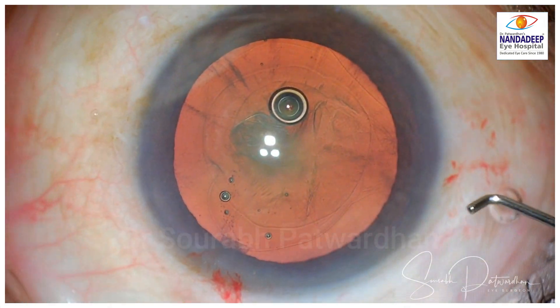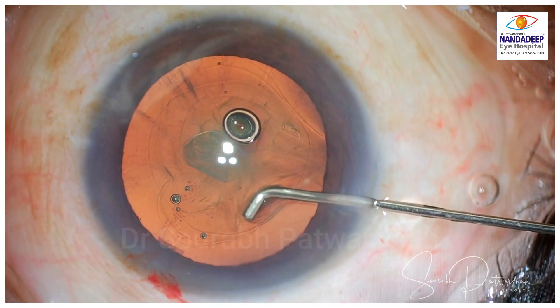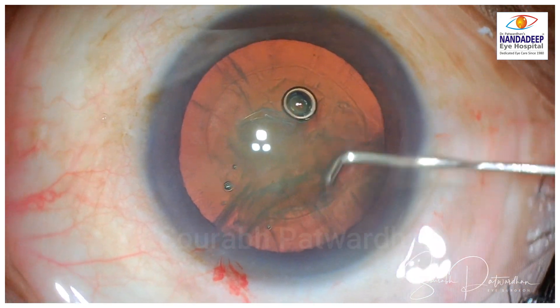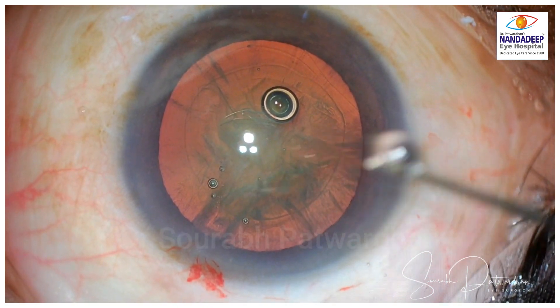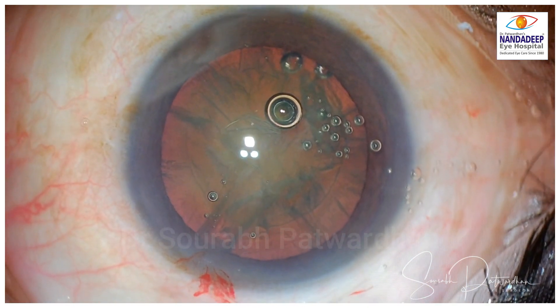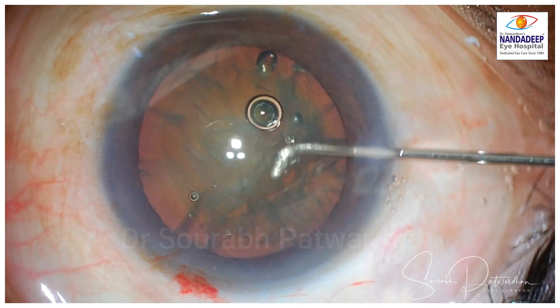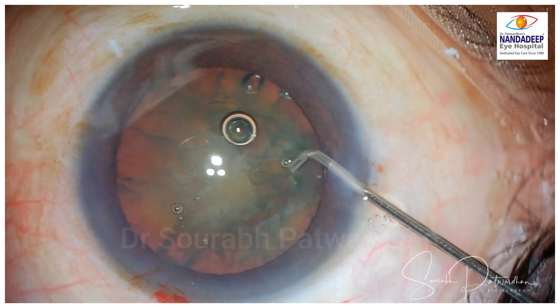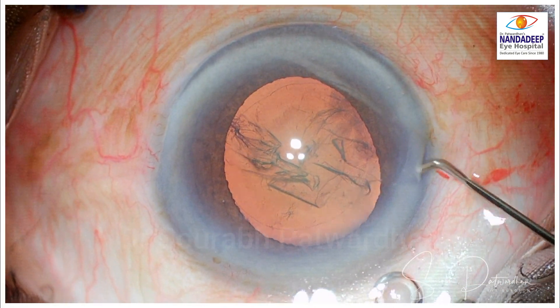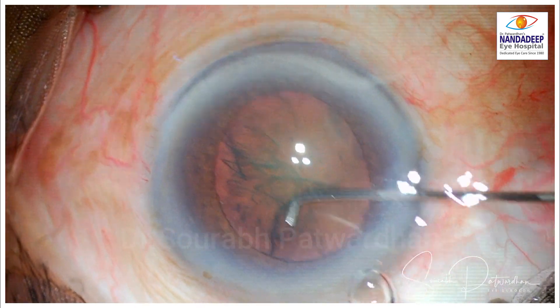I liked it in the first case and used it in a few more. In another case, it goes under the capsule — the fluid wave didn't come initially, so I tried on the other side. This small bend actually makes it more ergonomic, so you don't have to bend your hands too much. You can see a nice fluid wave now, and I could use the tip of the cannula itself to rotate the nucleus, saving time by not changing to a dialer.